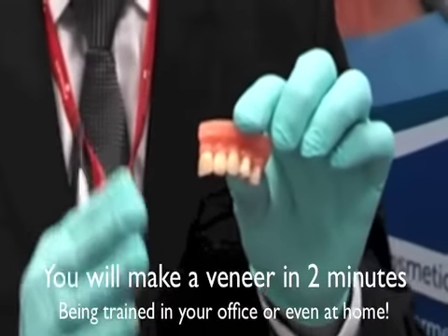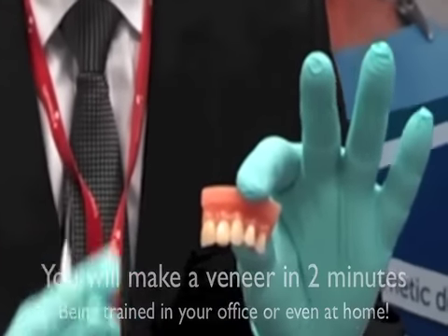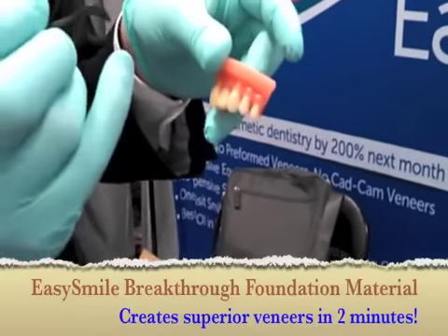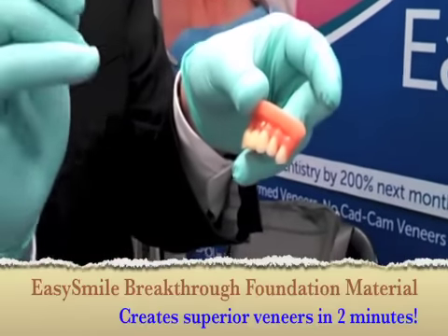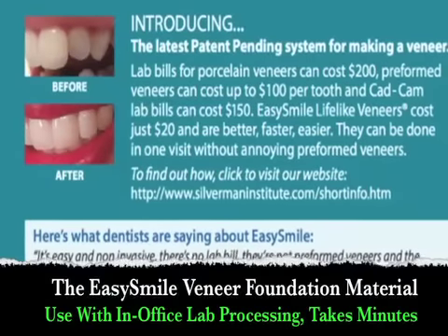For many dentists, the first time you do it, it may take you three minutes. Don't be hard on yourself. If it takes an extra minute, that's fine. You notice the material never stuck to the instrument, and it never stuck to my glove.